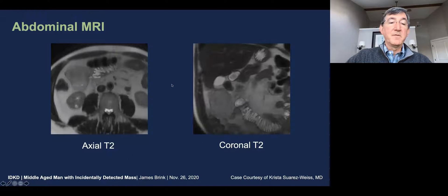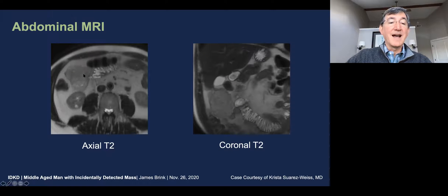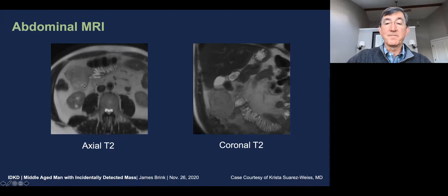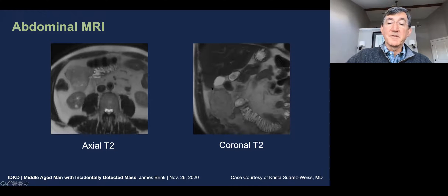T2 weighted imaging transaxial shows us the same mass, which is somewhat heterogeneous, predominantly hypo-intense relative to the cerebrospinal fluid, although there are a few scattered areas of hyperintensity. On the coronal T2 weighted image, we see a small pedicle to the adjacent right lobe of the liver.